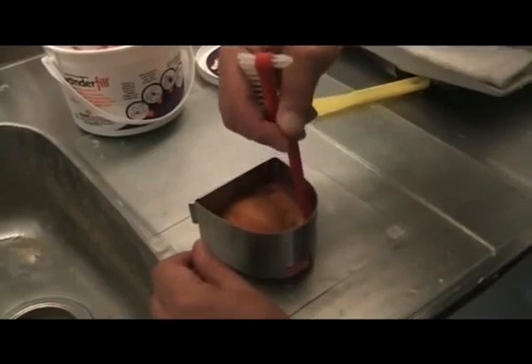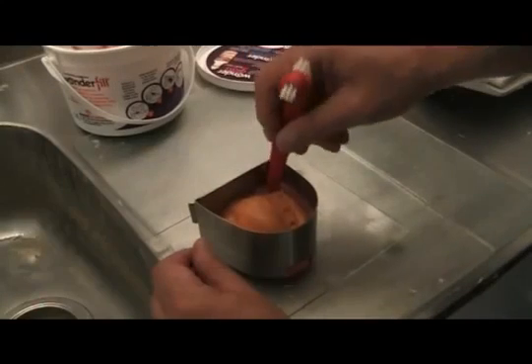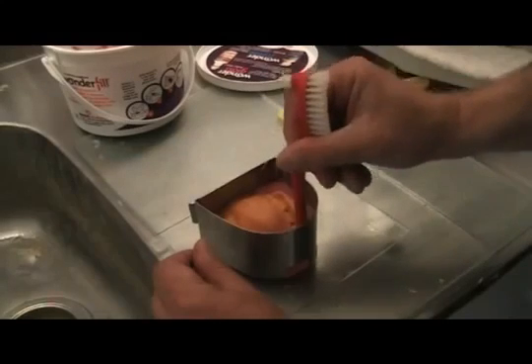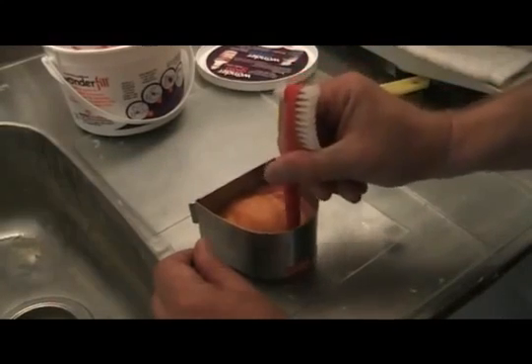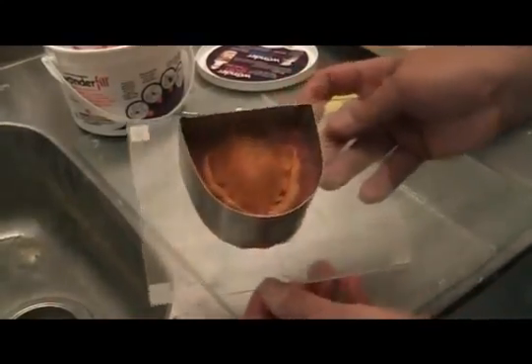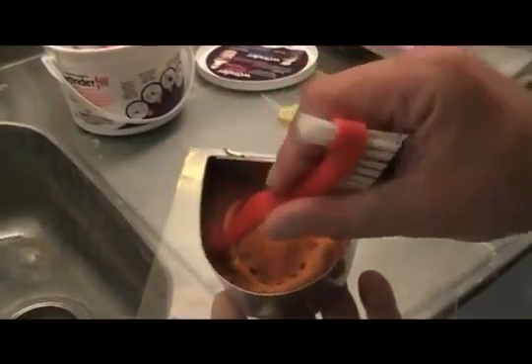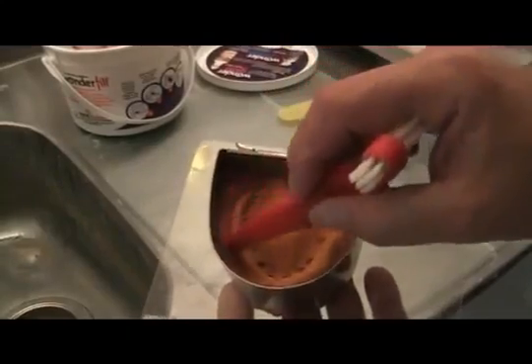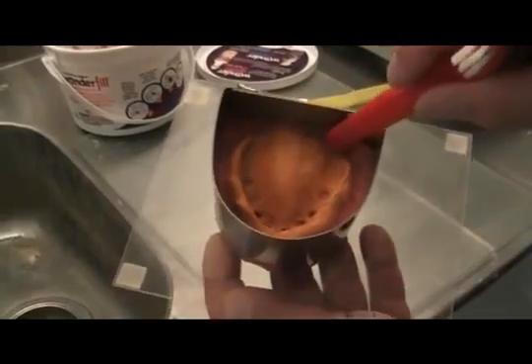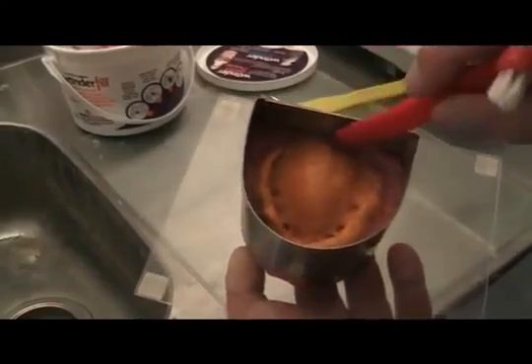And then, of course, the next step would be to fill the impression with your stone of choice and vibrate it. I'll show you that here in just a second, why I have that plexiglass base. Okay, there it is. It's boxed and ready to be poured. And you can see I have the land area. It's even with the line that I drew all the way around the impression. In the hamular region, I am below the hamular area so that I can pick up that entire notch. Nothing's distorted.